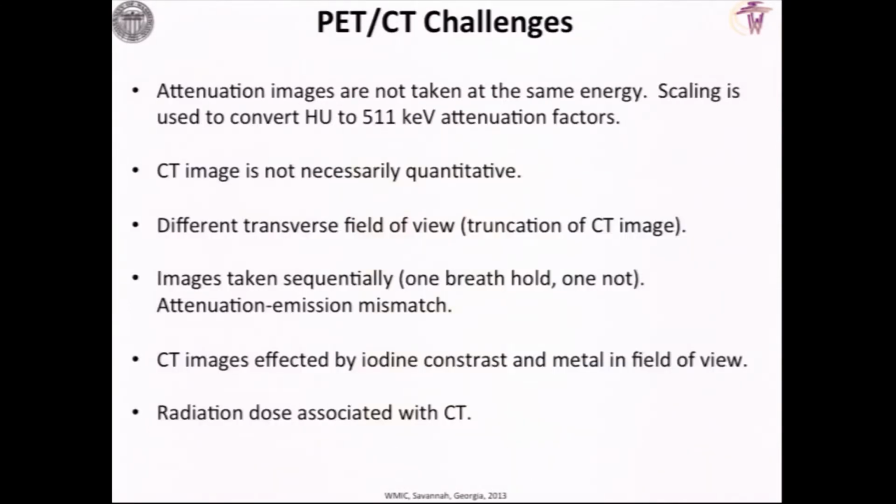Okay, so what are the challenges of PET-CT? First of all, the CT images are not taken at the same energy as the PET images. For PET, we're dealing with 511 keV photons. For CT, you're dealing with a polyenergetic range of X-rays, in the 60 to 80 kV range.